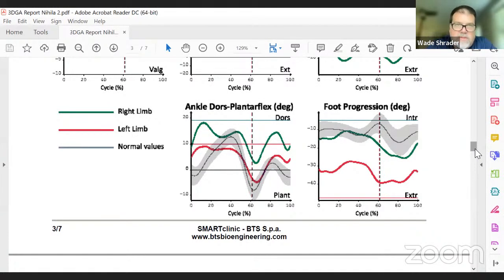That certainly goes back to your physical exam. We know that there's a bit of plantar flexor tightness. We know we have a planovalgus foot deformity, and this is very typical when you see that. Okay, but in that case, we know that there is a midfoot break. So do you disregard the ankle kinematics completely? Mostly, yeah. Mostly. Fine. So let's go to the next part.